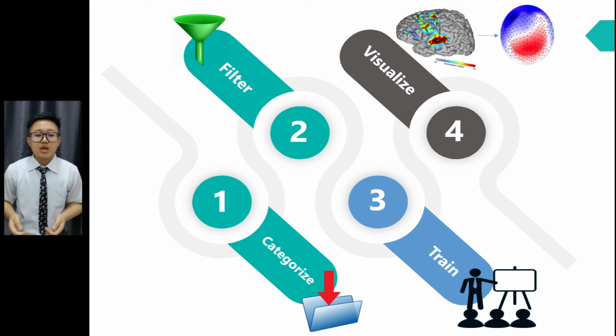These signals will then undergo filtering using filter bank common spatial patterns, or FBCSP, and ConvNets to filter out the bad signal data. Afterwards, the training for ConvNets to identify and analyze EEG data will be done using trial-wise training and crop training. Finally, novel visualizations of trained ConvNets will be done for visualizing of EEG data, and the accuracy of the visualization will be observed.